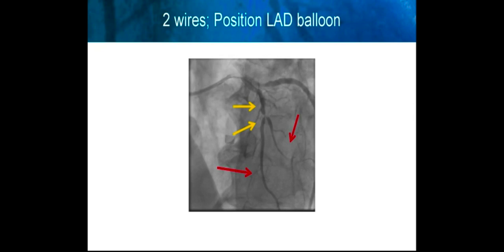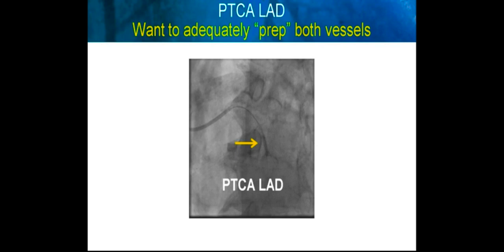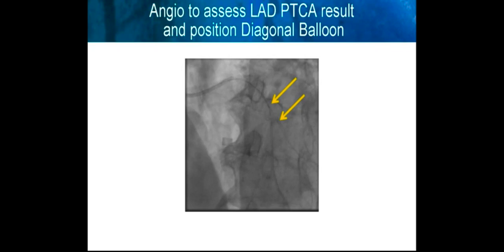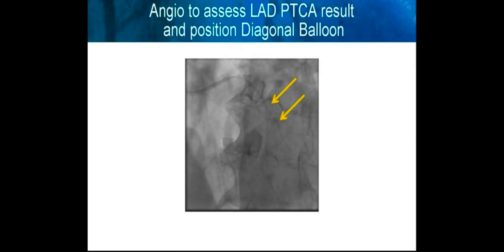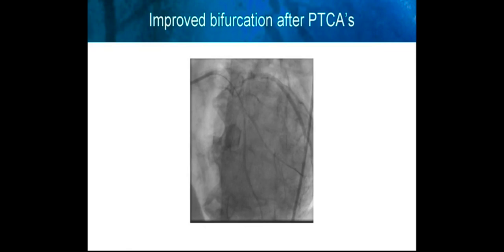Both vessels are wired, and here's a balloon in the LAD position to pre-treat the LAD first. Here's inflation of the balloon — very important that we want to adequately prep both vessels before implanting the Triton device. After this, here's the balloon in the diagonal vessel. We are checking our results of the preparation of the LAD and measuring in the diagonal before inflation, followed by angioplasty in the diagonal vessel. You can see the improved bifurcation preparation after angioplasty of both vessels. Both vessels are wired.